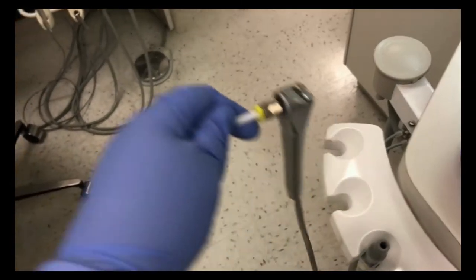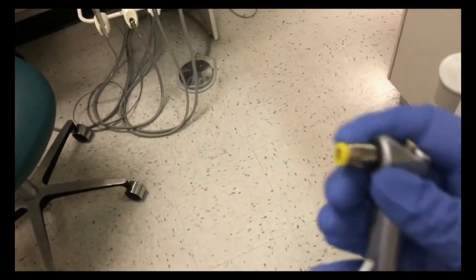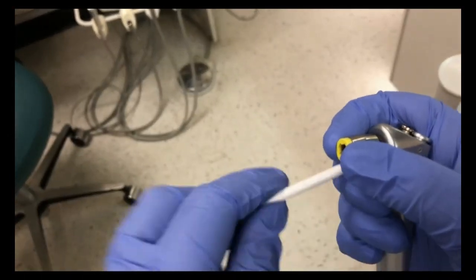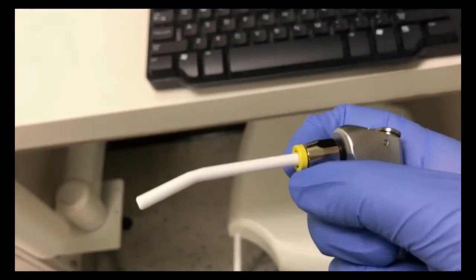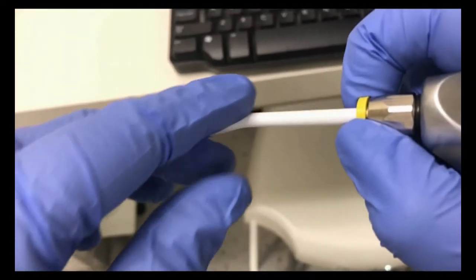To remove the air water syringe tips, pull back on that yellow ring with one hand while you pull out the tip with the opposite hand. Make sure to remove both air water syringe tips, both the assistant's tip and the doctor's tip.